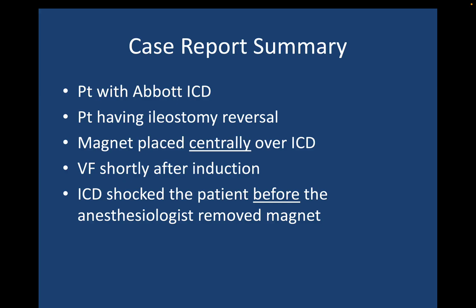Shortly after induction, real VF occurred. Now, the team was about to take off the magnet to let the ICD do the shocking, but before they even got the magnet off, the ICD shocked the patient. And the reason this happened is because the magnet was not in the right position. When they looked at the records, they could see that the anti-tachytherapy was going on and off because the magnet was moving ever so slightly and inhibiting and then not inhibiting the anti-tachytherapy.